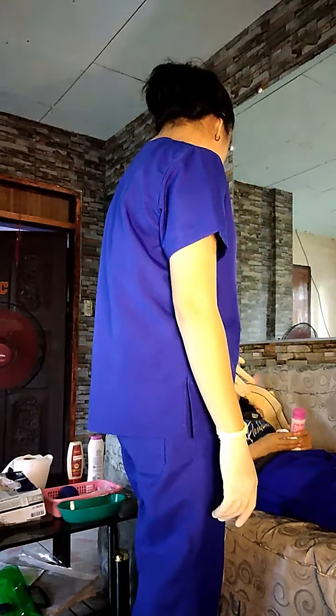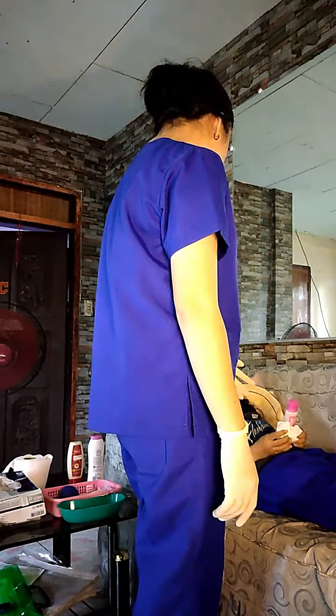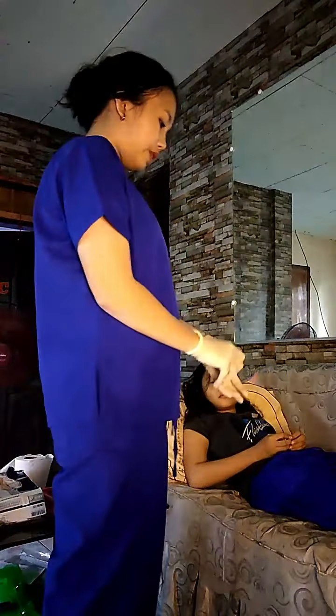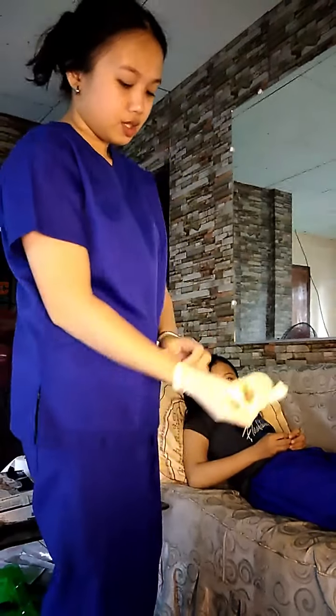Okay. So, after that, I will get this, and we dispose of the items we used. And then, I will remove the gloves and perform hand hygiene. After performing hand hygiene, I will now finally document. So that concludes my return demonstration. Thank you.